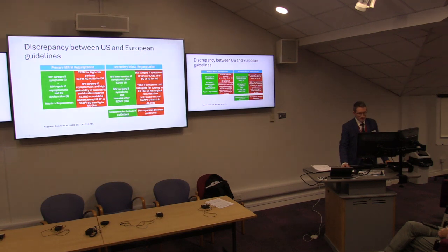But really, TEER is born out of this. So the COAPT trial, we'll touch on some of the trials in a minute, really came from this area in patients that probably we don't think benefit necessarily as well.